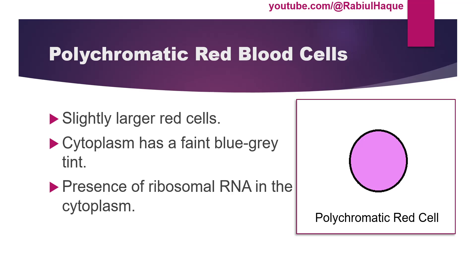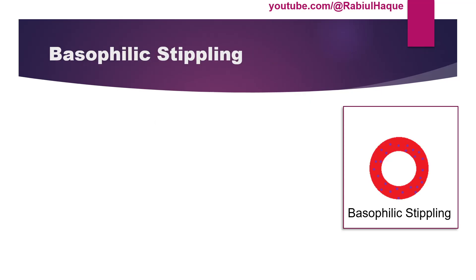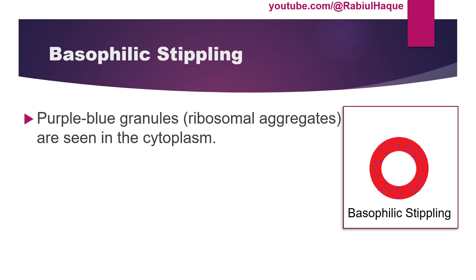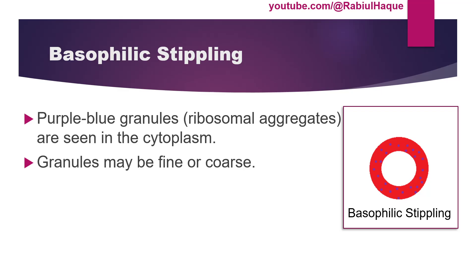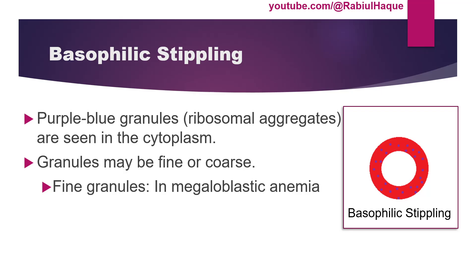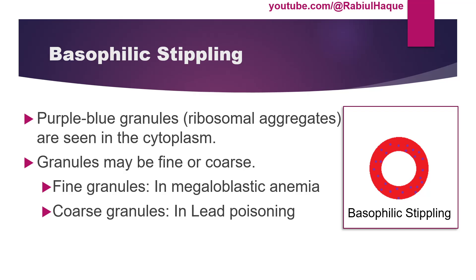Another term is basophilic stippling. Whenever we hear basophilic we should think something bluish — here purple-bluish granules representing ribosomal aggregates are seen in the cytoplasm of red blood cells. These granules may be fine or coarse. In megaloblastic anemia the granules are fine, whereas in lead poisoning the purple-blue granules are coarse in shape.